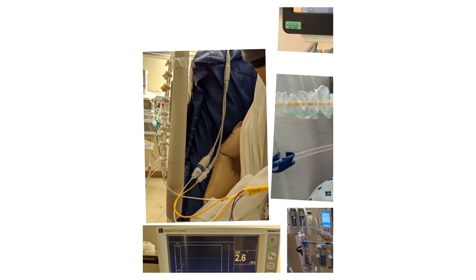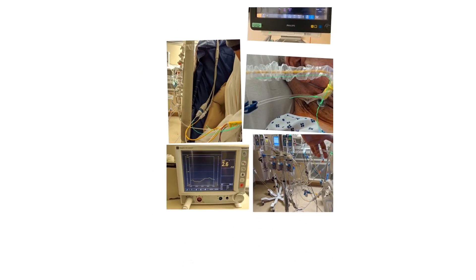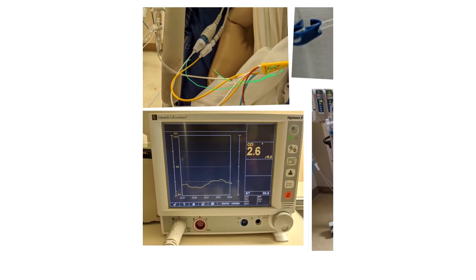This is the port connected to these cables — the one that usually measures cardiac output and cardiac index. It's connected here and gives us the cardiac index, which is 2.6 for this patient. We'll discuss the importance of these numbers shortly.